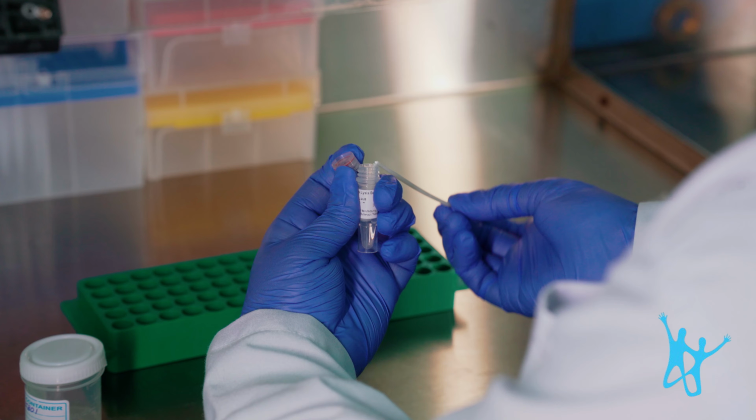The kit contains ready-to-use real-time PCR lyophilized amplification beads for the detection of MTB and MDR-TB, positive controls, molecular biology grade purified water, quick lysis buffer with sterile swabs. Always verify the lyophilized bead labels before starting the assay. Additional materials required include Huwel Thermosonics device, micro pipettes with filtered tips, and a compatible real-time PCR instrument.